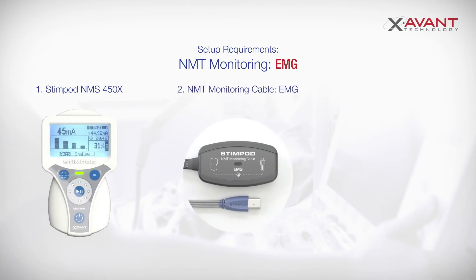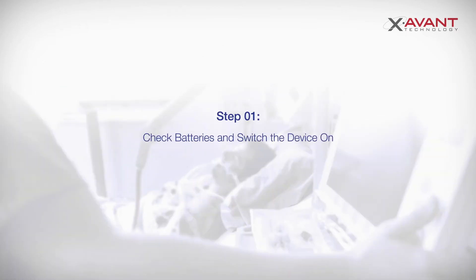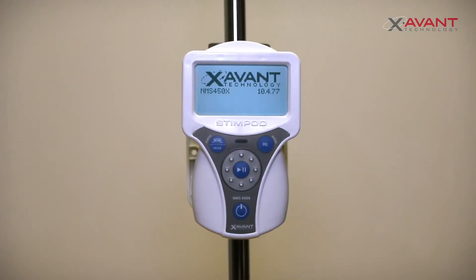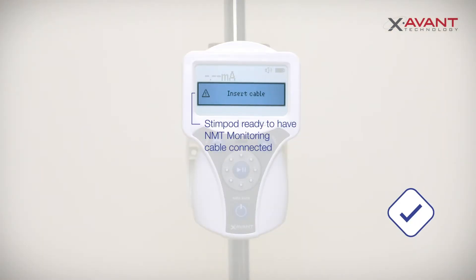an NMT monitoring cable EMG, and an EMG electrode. Start off by checking that the batteries have been correctly inserted and switch on the StimPod. An 'insert cable' screen prompt will appear. The StimPod is now ready to have an NMT monitoring cable connected.